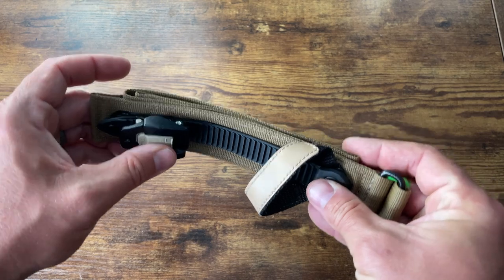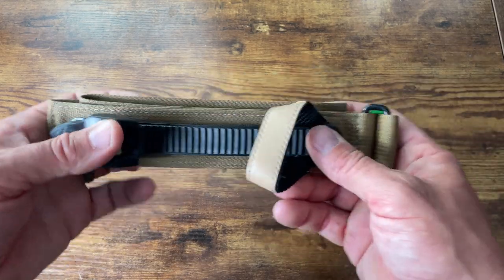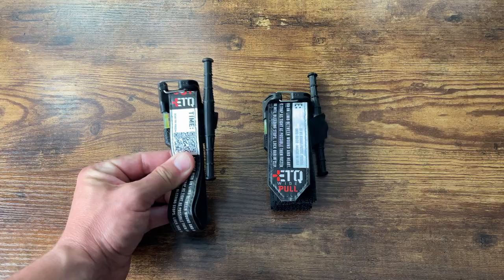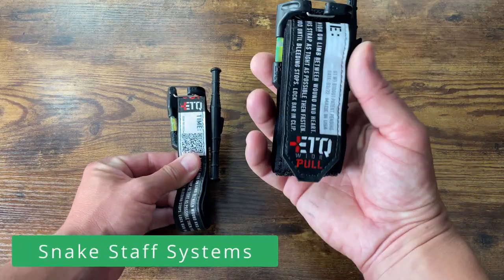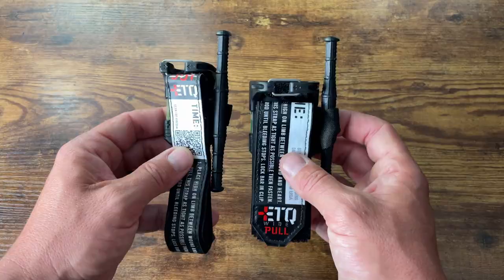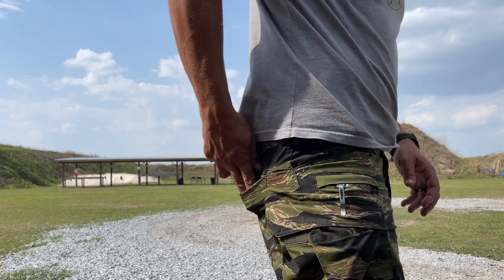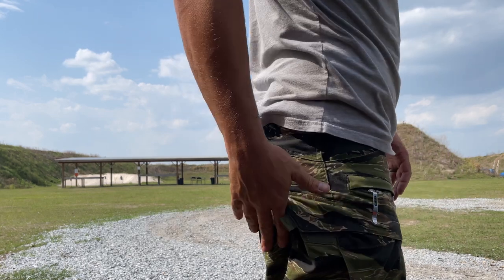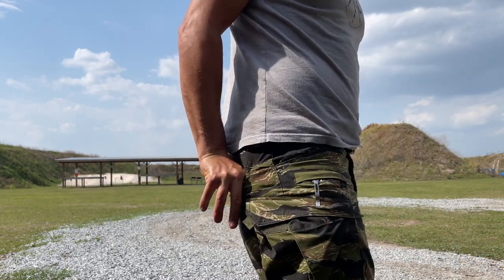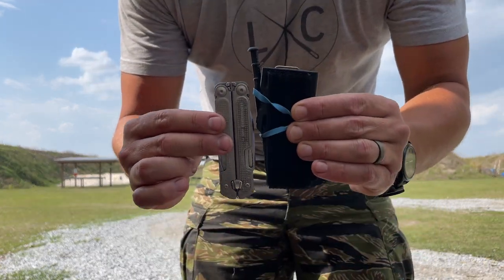I don't know of any aftermarket carriers or tourniquet holders for the RMT, but I'm sure there's some out there. They're not exactly brand new to the market but they are underrated in my opinion. Last but not least, Snake Staff Official - they make these smaller tourniquets and they're very popular right now. They're hard to get - they do drops every so often and they sell out in probably five to ten minutes. Everyone likes them because of the form factor: very small, but they also have some unique features.